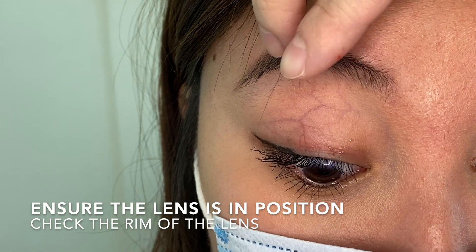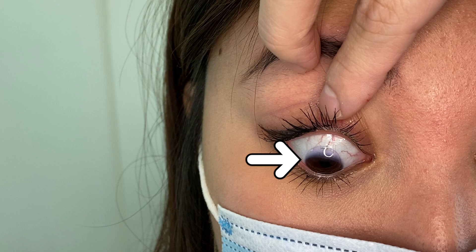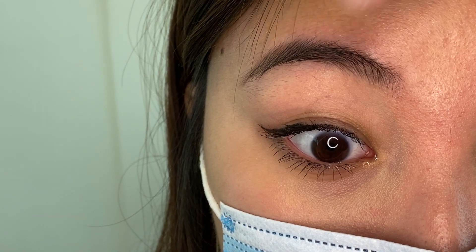Now, to check if the lens is in the centre of your eye, simply pull up your upper lid and look at yourself in the mirror. You will notice the coloured part of the lens is covering your iris.